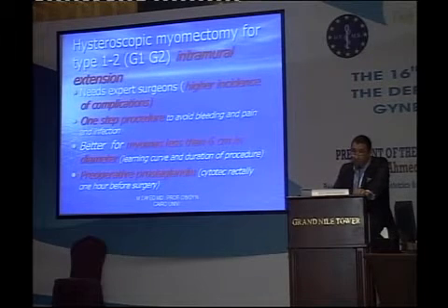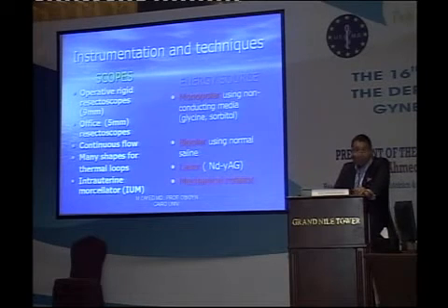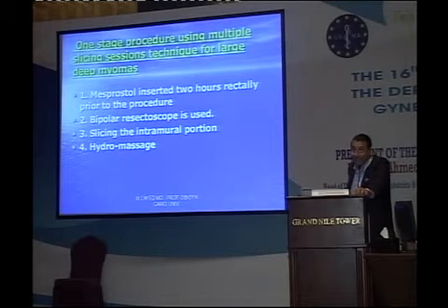So, for hysteroscopic myomectomy, in the study I'm presenting, we're using the rigid resectoscope, the bipolar system, and continuous flow. So this is basically the procedure. You have other options: monopolar, laser, and mechanical rotators. We'll talk about those later in the next presentation by Dr. Hisham.